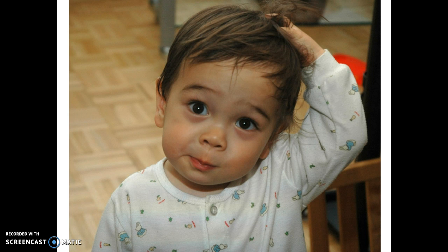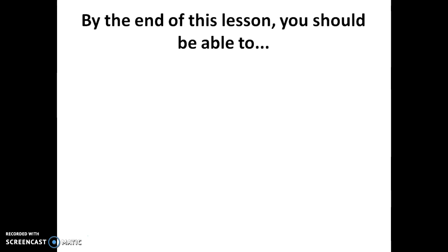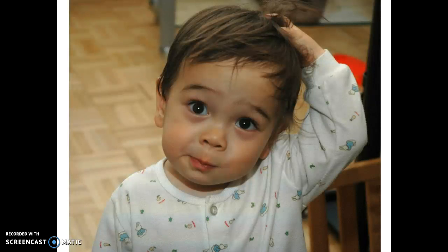A lot of us, certainly when I was a junior, and somebody gave me a pediatric ECG, I probably looked a bit like this. And I see this expression a lot of the time when some of my juniors come up and ask about an ECG that they've done. It's confusing and it's concerning because it looks strange compared to the adult ones that we see all the time. And the thing is, they say up to 20% of pediatric ECGs that we do will be abnormal.